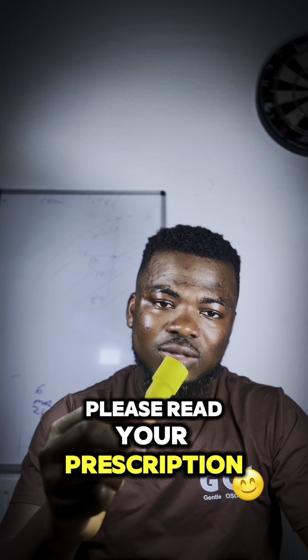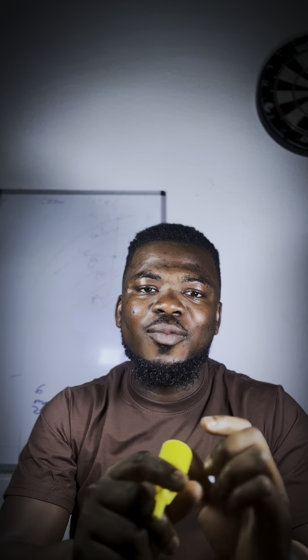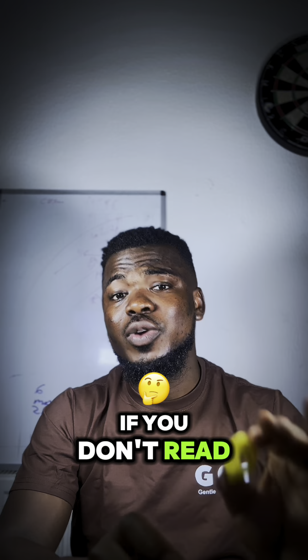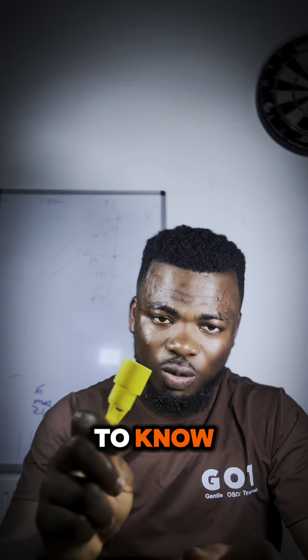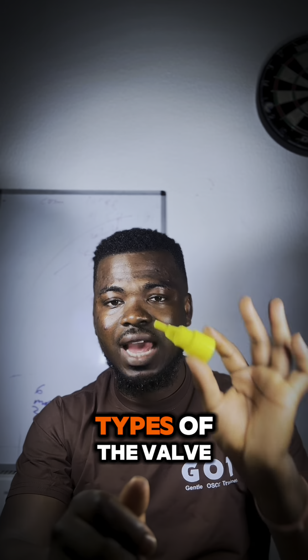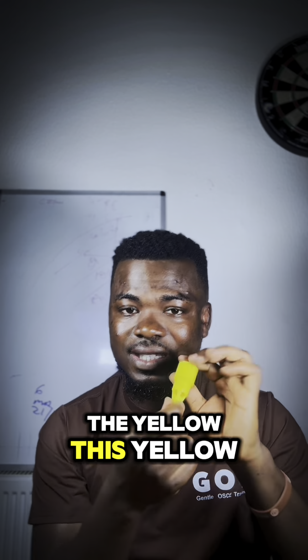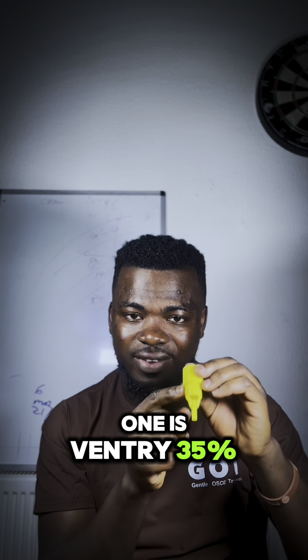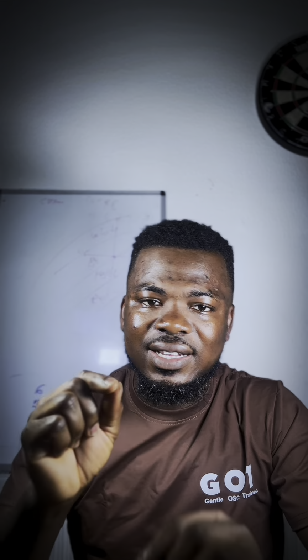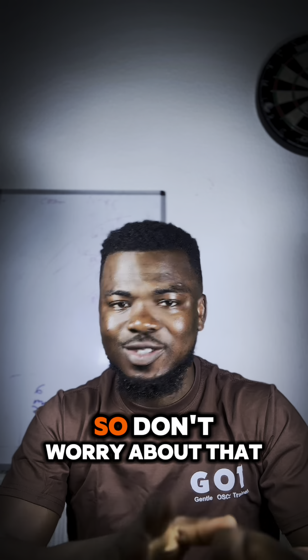Please read your prescription so that you know the type of valve you would choose when the delivery device is venturi. If you don't read the prescription, then you are not going to know which of the valves you are to select. Remember, we have different types of valve: the white, the green, the red, the blue, the yellow. This yellow one is venturi 35%, 8 liters per minute. Just as I said earlier, this will be stated in the prescription, so don't worry about that.